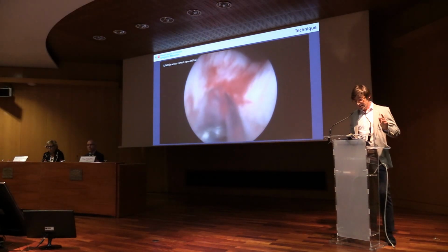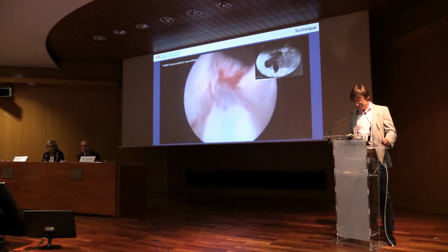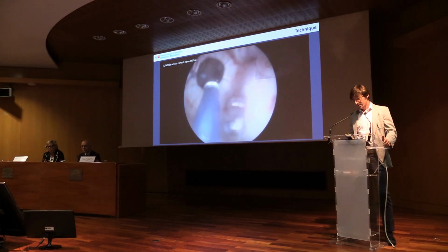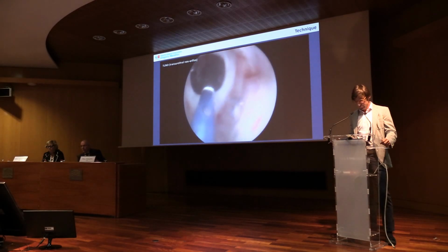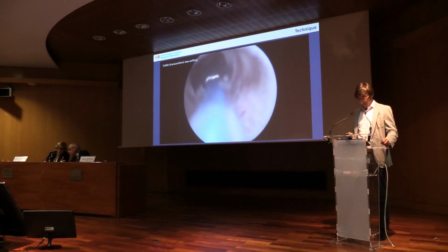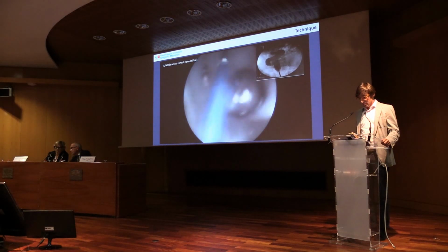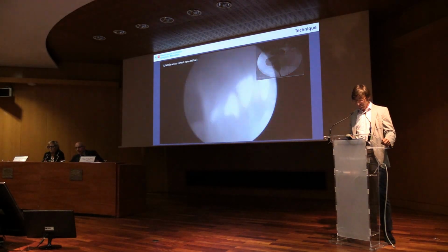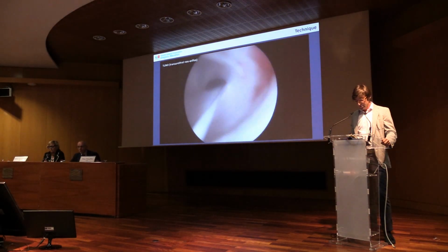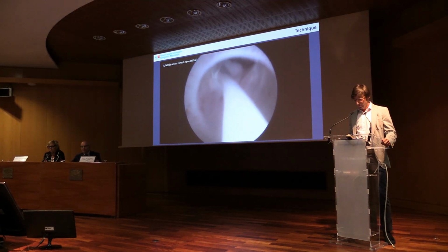After that, a guide wire is passed into the ureter, followed by a high-pressure balloon catheter, which is inflated to its nominal pressure of 14-15 atmospheres, creating the neo-ostium. Finally, once the neo-ostium is created, we place the double-J stent, which is removed 1 month later.